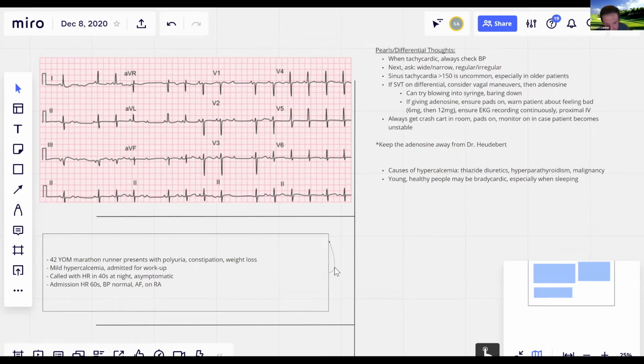Okay, Norma. EKG class. Oh boy. I'm probably going to need some help. Get someone to help you, but don't worry. Okay, perfect. So the first thing that I see, his rate is not regular.